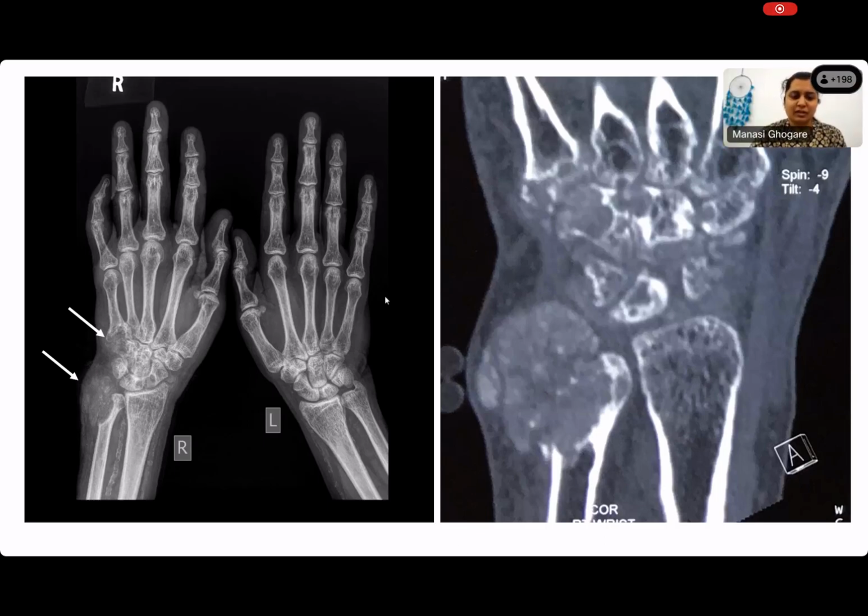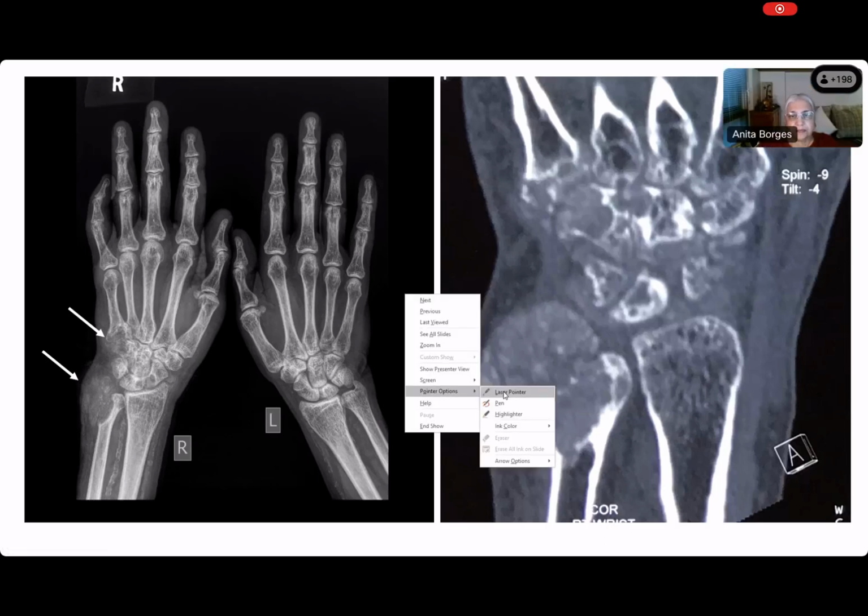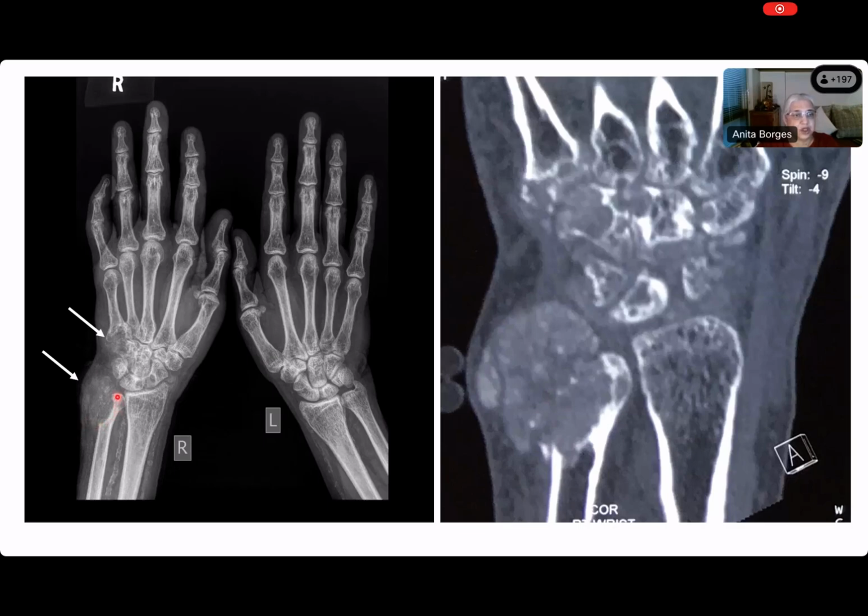You can see that it is very nicely scalloped, because this thing has scalloped the bone. Now the meaning of the word scallop is what, Mansi? It's like taken a scoop out of it. Very good. Excellent. It has taken a scoop out of it. All right. What do you want to say about the other lesion that you've seen over there? Ma'am, that is also a lytic lesion, but it does not show peculiar scalloping.